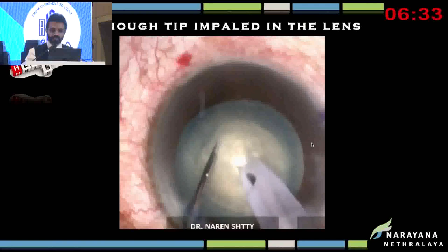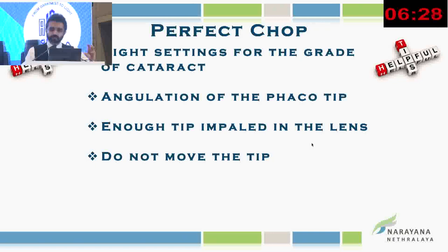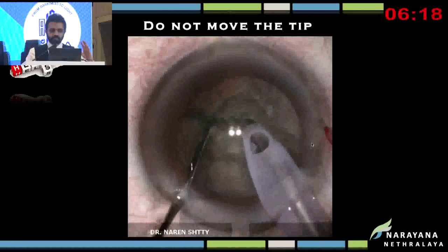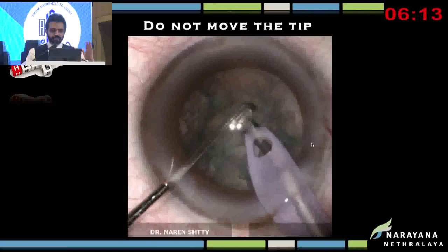Now, the other thing is, once you have got a good hold with your phaco tip, do not move your phaco tip. Keep it still. This is very, very important. Otherwise, you create iatrogenic breaks of the zonules. If you see here, once I've got a good hold, my phaco tip does not move. Only my chopper moves. I can show you here again, my phaco tip doesn't move, only the chopper moves. This is very, very important.